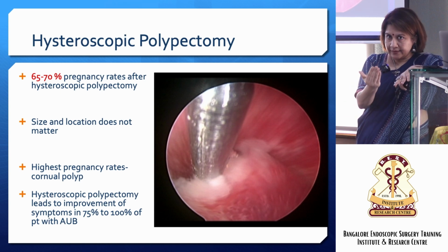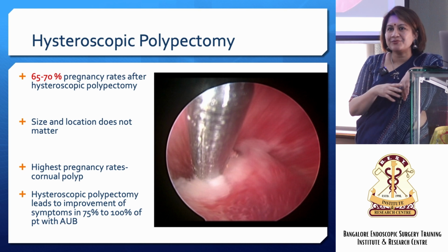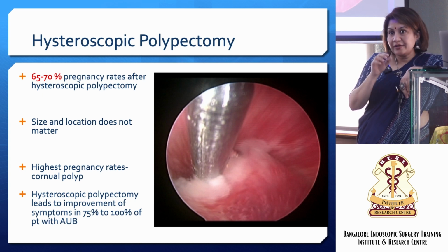So you need to maintain that distance. That is where the initial challenge will be. That's what I said. Even if you perforate with the scissor, nothing can happen to the patient. Nothing major. It's only that you will not finish the procedure. But I end up actually keeping very near to the scope. And it just doesn't open up. No, don't keep it too close either.